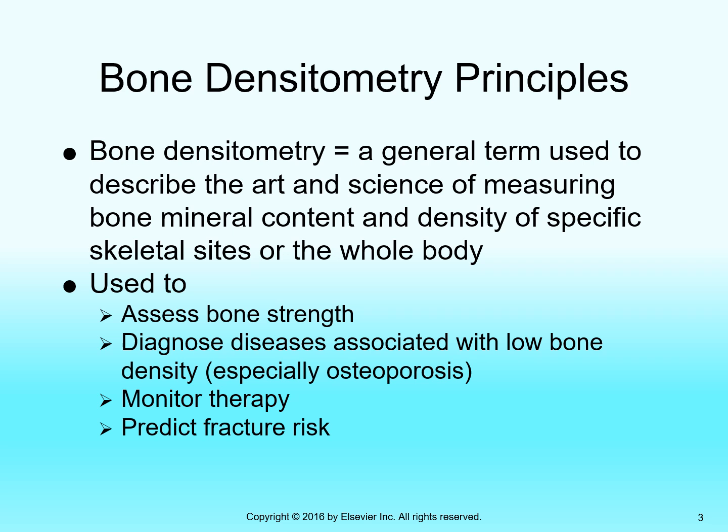There are really two that are very common: a hip fracture and a compression fracture of a lumbar vertebra. Those are the two most common fractures resulting from osteoporosis. They're specifically caused by the bone tissue thinning out excessively at those two areas. So we can make a fracture risk assessment with bone densitometry.